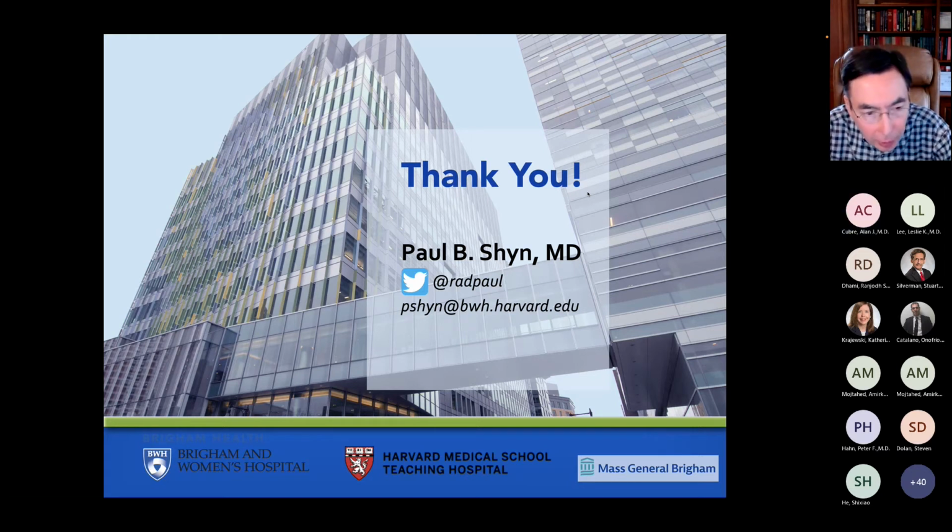Yeah, it can be challenging. And part of the problem is that we don't always see the tumor ghost in the ablation zone. We often see a non-enhancing ablation zone and the tumor is obscured in it, so it makes it a little hard to know what the margin really was. Sometimes on MR, we do see the ghost. What I would say is look at all the sequences to see if you can identify the ghost of the tumor. That'll help you. Otherwise, we just have to decide: if it's a fairly uniform or circumferential rim of enhancement, it's probably benign.